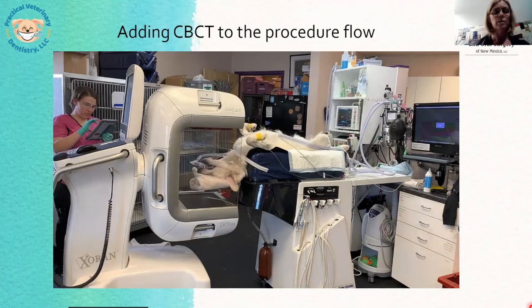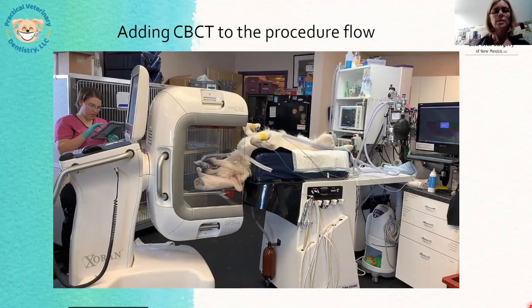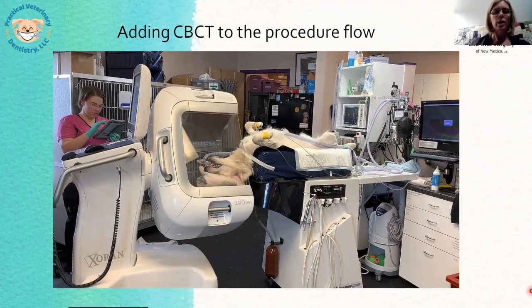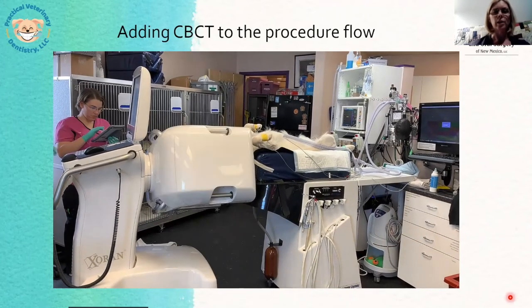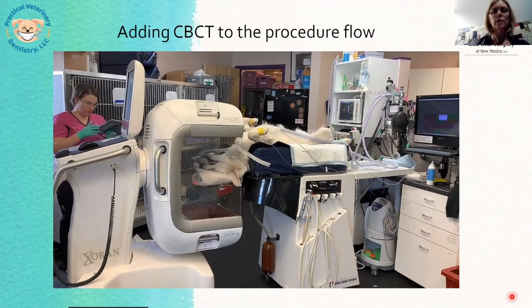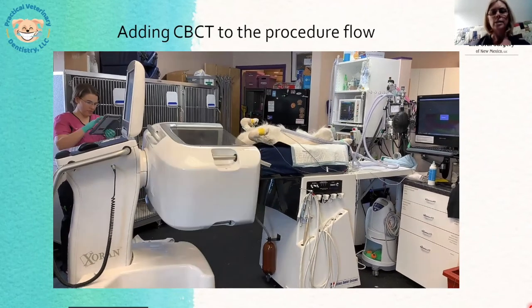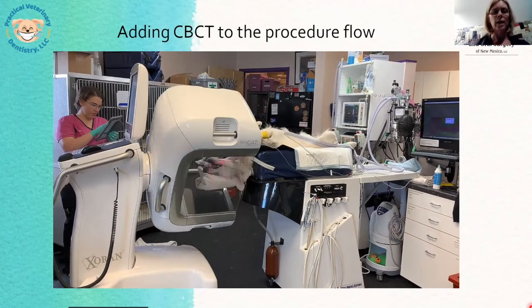So here is the video that is showing the scan in progress. You can see my technician, Chrissy, there. She's our anesthetist working on her iPad, monitoring the anesthesia. And this is doing the scans. This is actually taking the cone beam CT scan. And as it completes its full circle, it will be done. And that is all it takes.